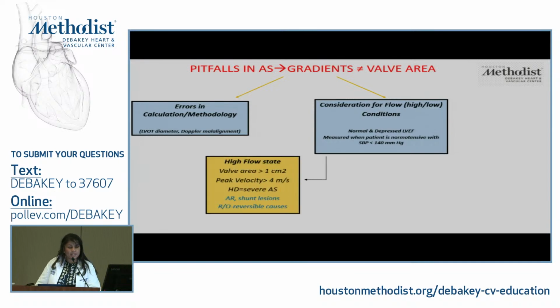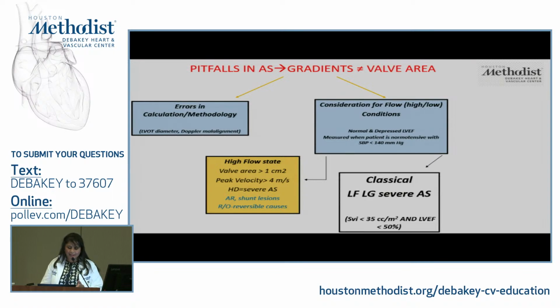And what is a high flow state, right? We have seen this very often in liver patients who have hyperdynamic cardiac output, with valve area of more than 1 and peak velocity of more than 4. But what's important is that we know it's a high flow state, but we need to identify when it's reversible. Is it anemia which is causing this? Is this a patient who had a GI bleed, and now their gradients are high when they were normal the day before? There's a secondary component going on. And then obviously, once we have established all that, now we know that for sure the flow is low.